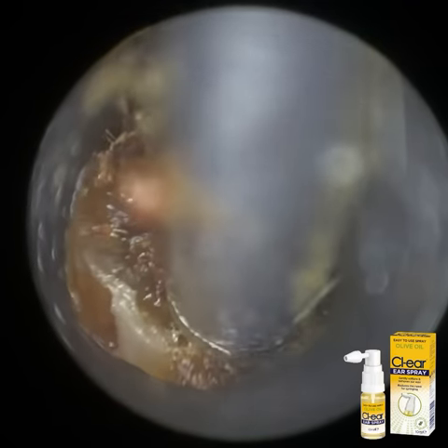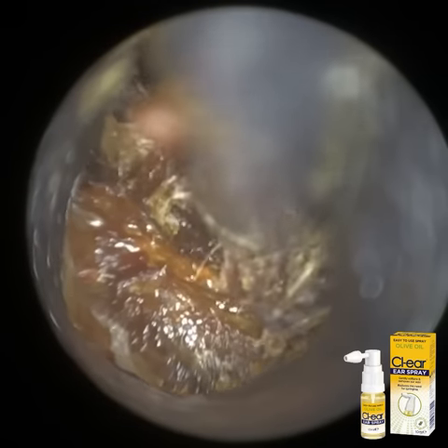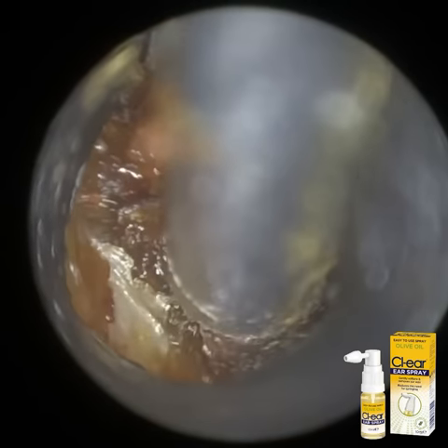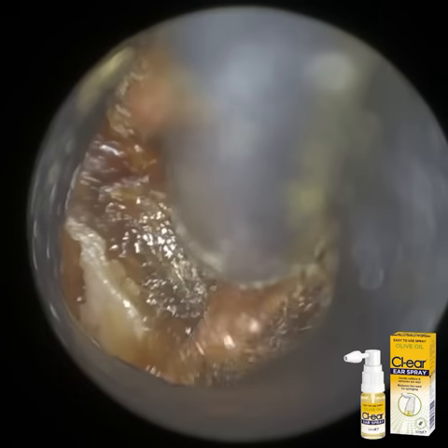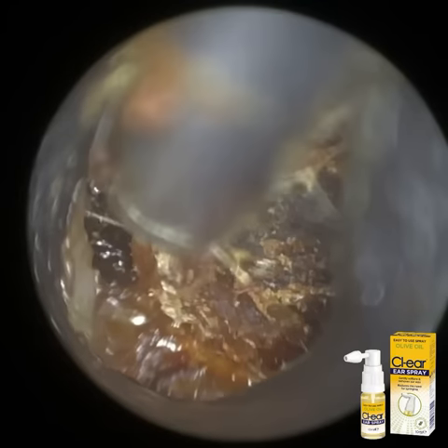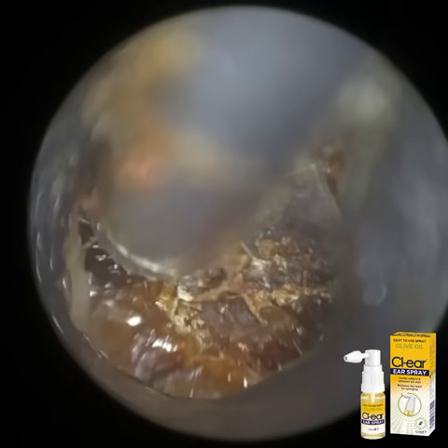So I'm just going here more to the base of the ear canal and then posteriorly to the back canal wall. It's quite a solid piece. And in a moment, I'm going to instil some olive oil spray.